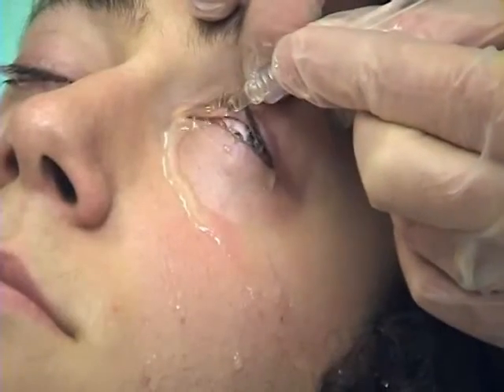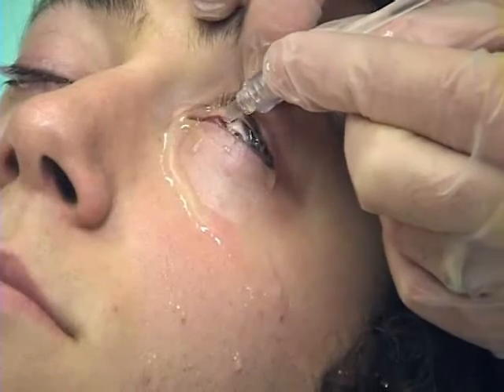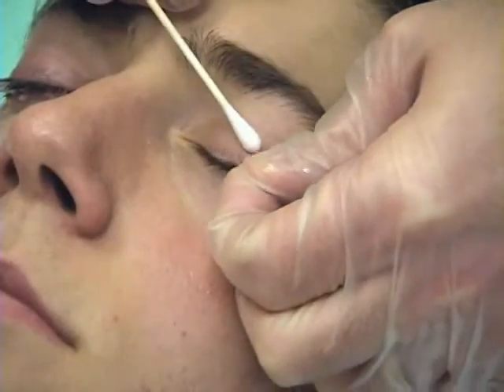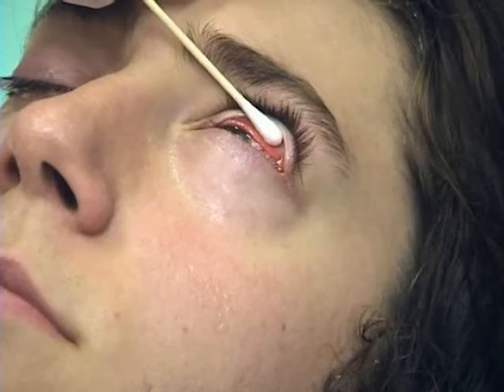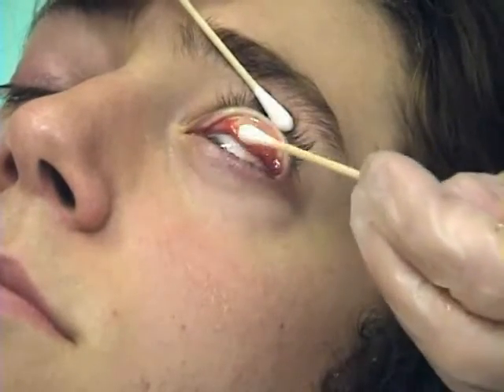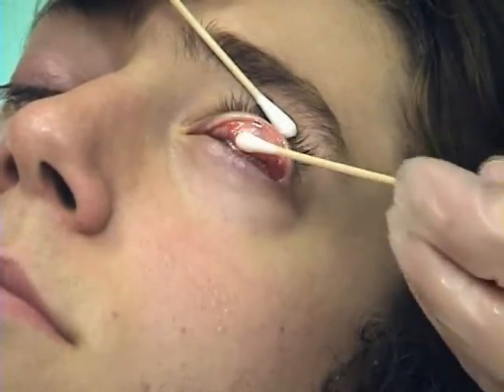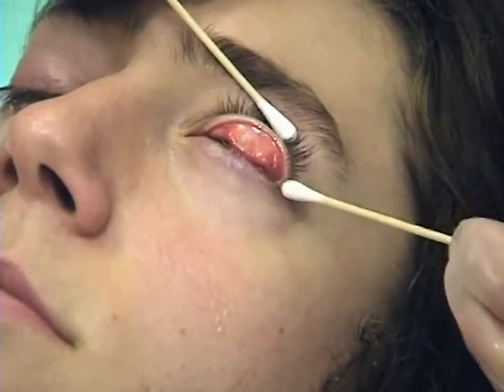After the irrigation is complete, evert the upper eyelid to ensure that there are no residual deposits in the superior conjunctiva. Apply gentle pressure to the superior part of the superior tarsus with a cotton-tipped applicator, then lift the upper eyelid margin upwards and backwards toward the patient's forehead. Hold the everted eyelid in place with the applicator and use a second applicator to remove any visualized foreign material.